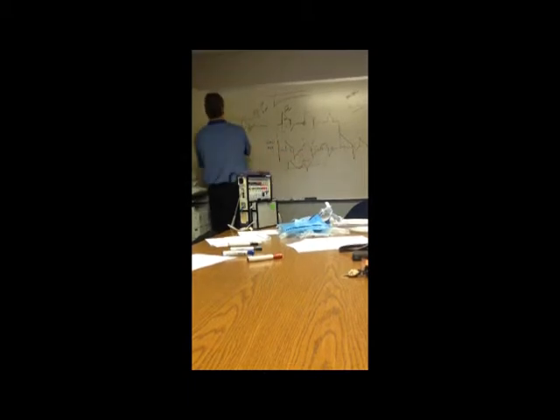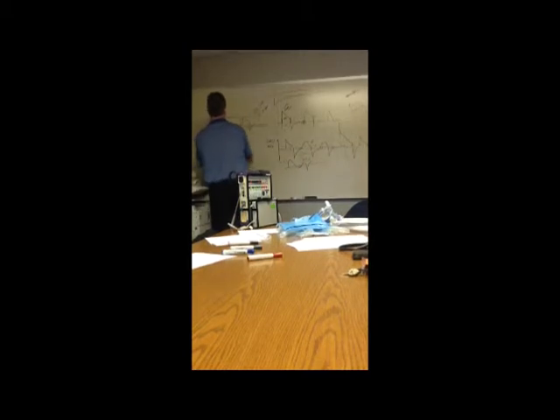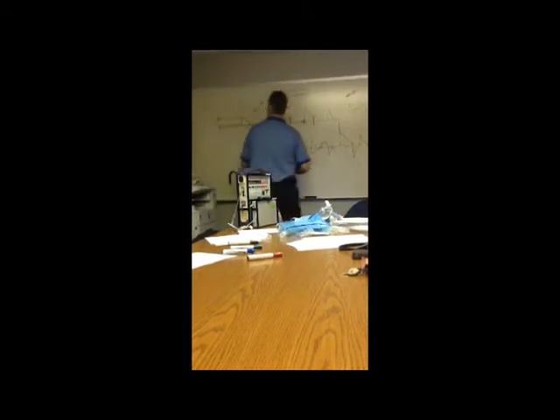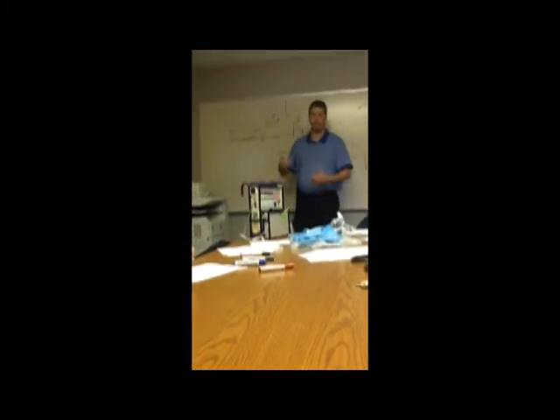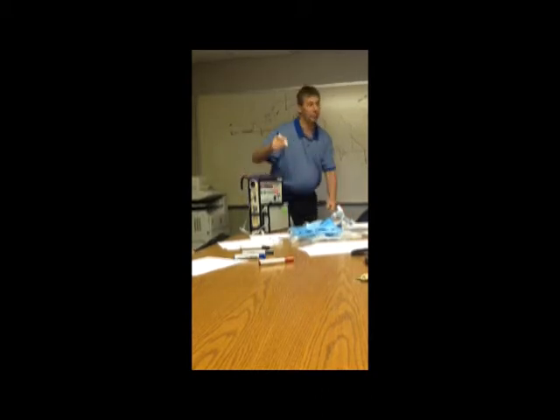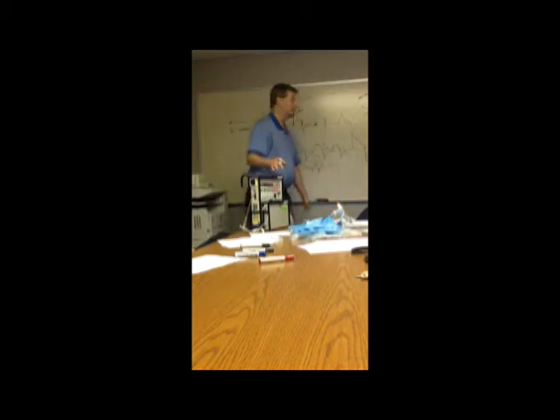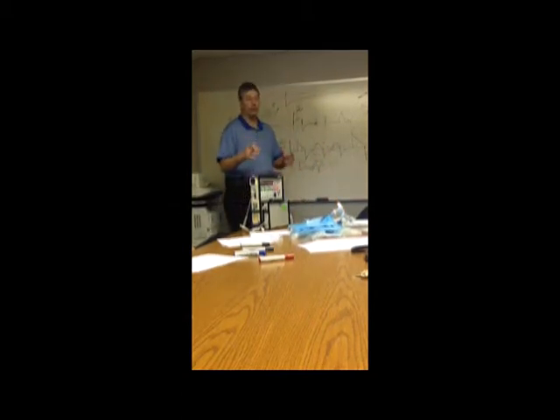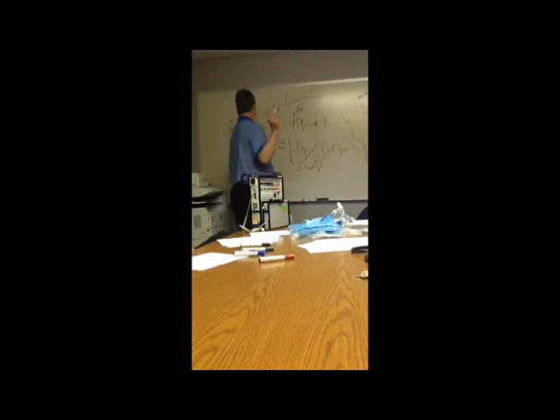So on all the BiPAP machines around the world that are BiPAP only, this number is 20 and this number is 5, okay? This one is 0. Y'all can see that. So when I sat on a BiPAP machine in the hospital, 20 over 5, the peak pressure is going to be 20. And expiratory pressure, like it is now, is going to stay at 5. All right, on these machines I've learned, and we have transport iVents that we used to transport. I think we put them in the bus with you guys a few times, taking somebody long-term maybe. We may have just used yours.